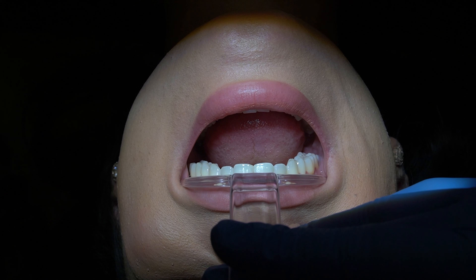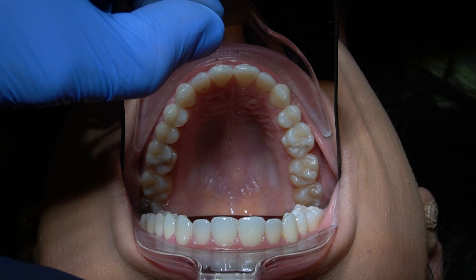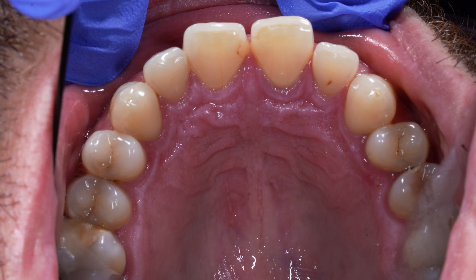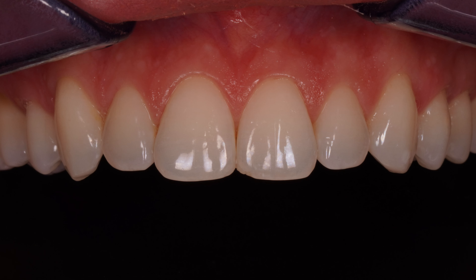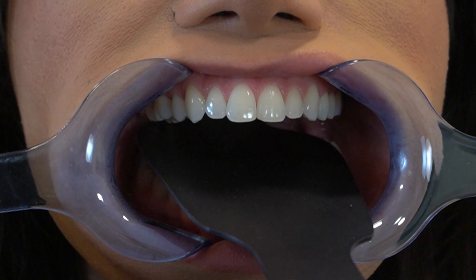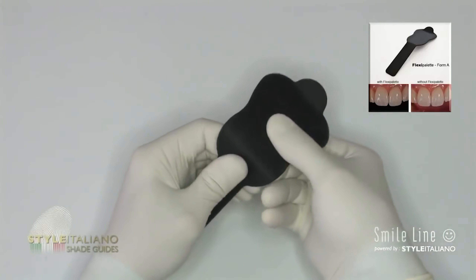Beyond the camera, you'll need cheek and lip retractors, contrastors, mirrors and microfiber cloths. I personally prefer plastic cheek retractors as they're a bit more comfortable for the patient. Lip retractors are essential for occlusal shots — without them the patient's lip curls over the edges and you end up with fingers in your photos. Contrastors are great for anterior cases as they give you photos with black backgrounds. I suggest the silicone-coated ones because they're more durable, don't scratch as quickly and are more comfortable — with metal ones you might accidentally hit the patient's teeth and fracture a bit of the tooth.